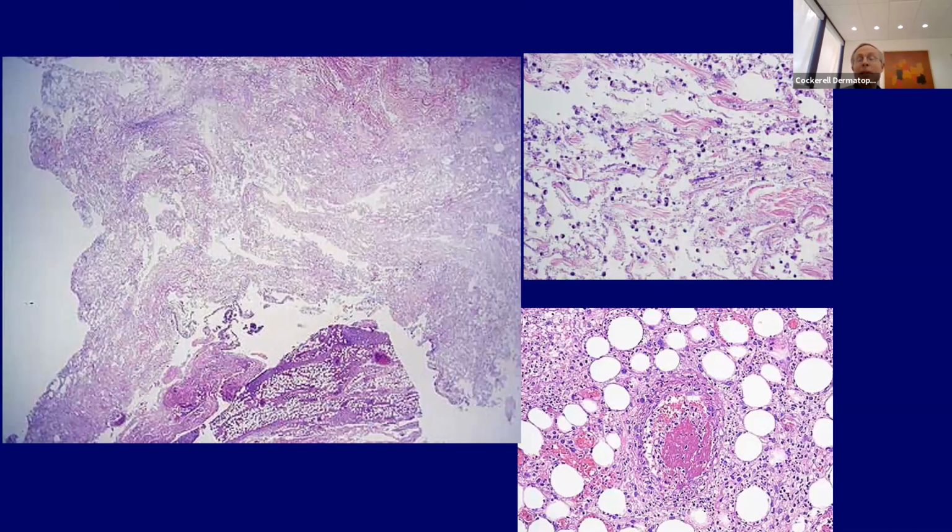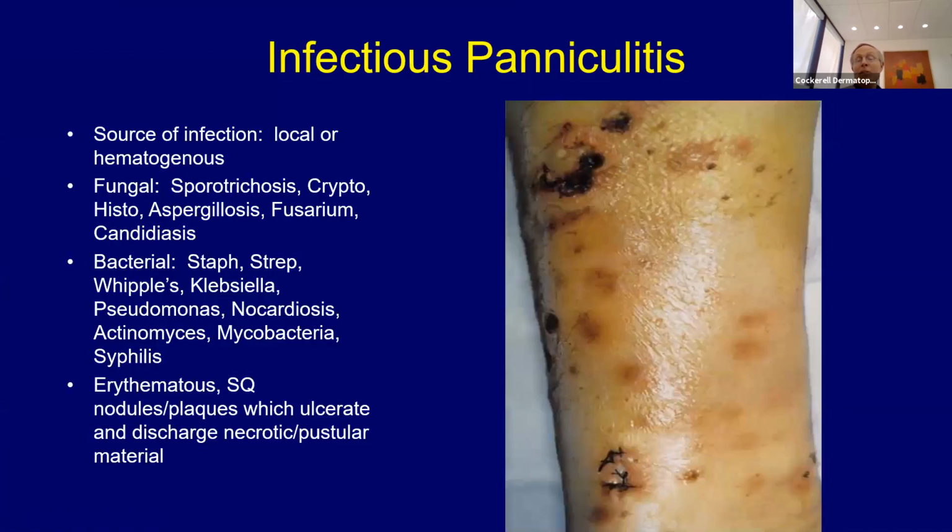Surgery needs to be called in here. They go in and just fillet the area open so that the ischemia doesn't go deep and then cause gangrene, where they lose limbs. So here you get this diffuse septal inflammation and the blood vessel was involved as well. This is secondary vascular inflammation just because of all the inflammation. So this isn't targeting the blood vessel, it's just hitting it because it's wiping out everything in its path.